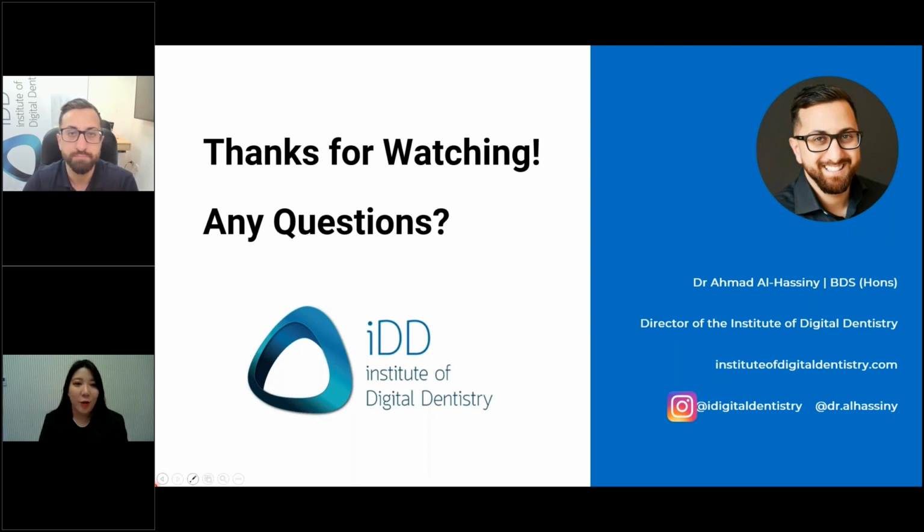All right, next question. How many units of the bridge are you working on? I'm not sure I quite understand that, but if you mean how many units I've scanned, I've scanned everything from like a 4 unit. That's probably the maximum I would do for a bridge anyway, because anything more than that, I'm usually thinking implants or something else.